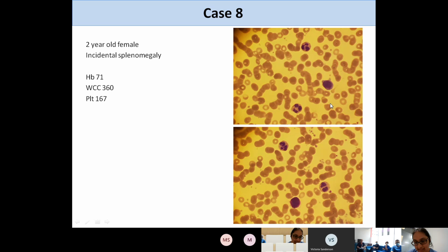So what you can see here are neutrophils, but you can also see what looks like a granular cell, but it's not got the normal segmentation. We've got some neutrophils here as well. And then here we've got another type of white cell that is very, very granular with deeply staining purple granules. This is a basophil, and in general, you shouldn't see a lot of these in the peripheral blood. And if you do, then you are thinking there's something wrong with the myeloid system.